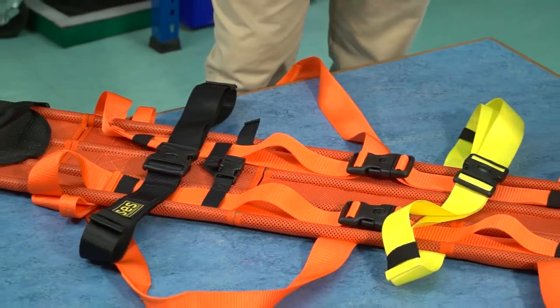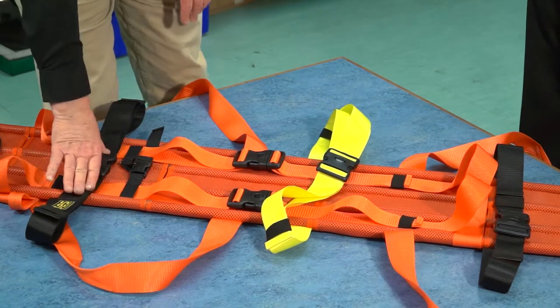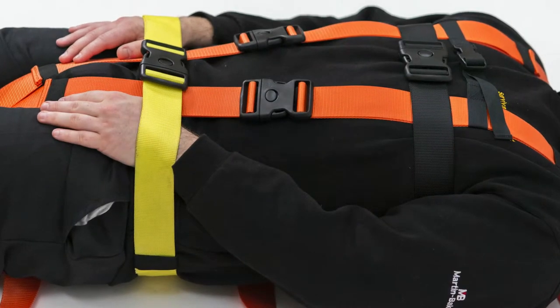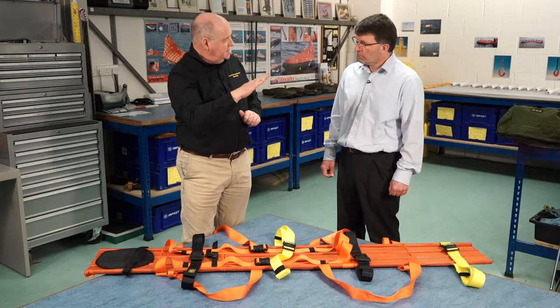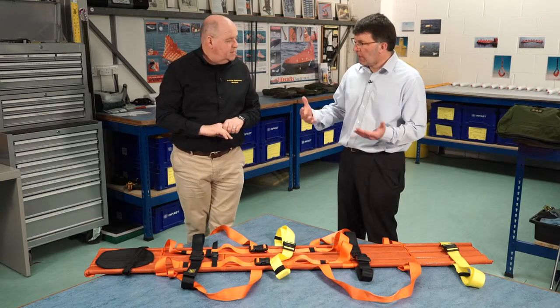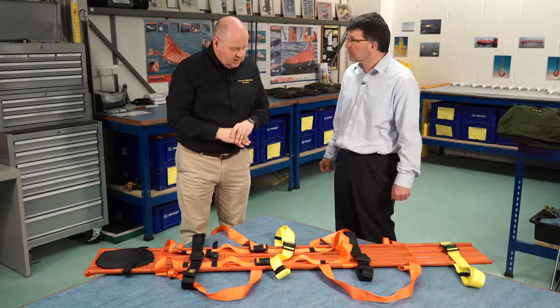There's also a longitudinal strap — what's that for? These are a full body restraint harness that goes on before the other straps are attached. It will secure you around the crotch area, around the legs, and then over the shoulders with a restraining strap across the chest. This will keep you in position when you're moved into different angles — up and down or even vertically — it will still restrain you in the harness. So if the patient is being transported over rough ground or up a lift shaft, they're basically going to be completely safe. Yes, correct.